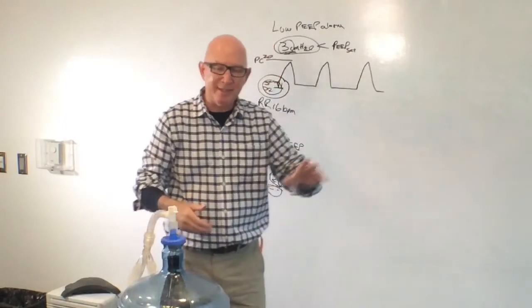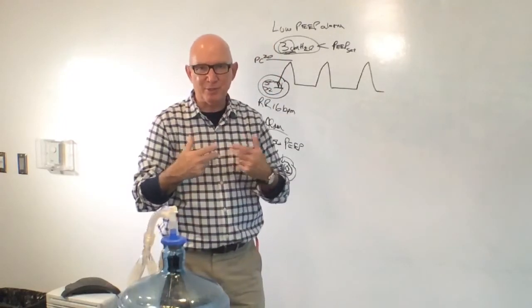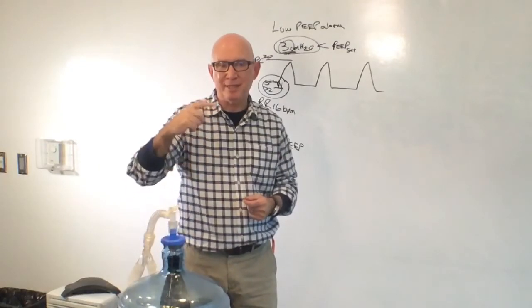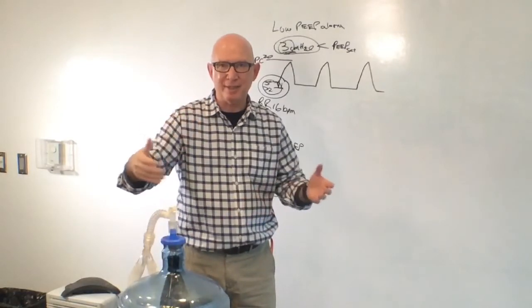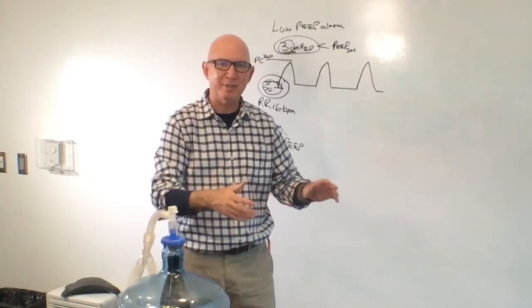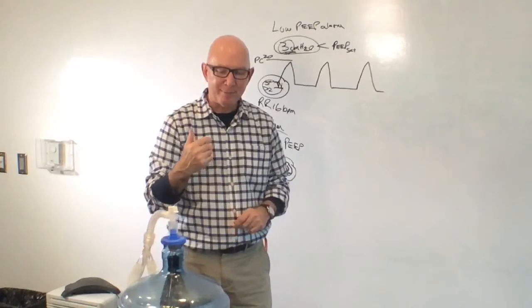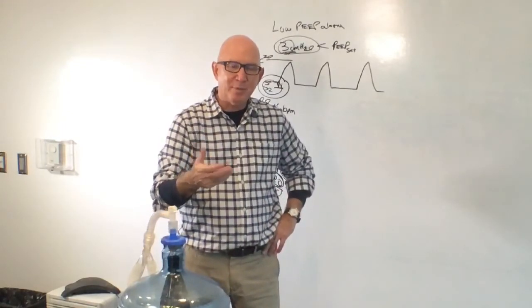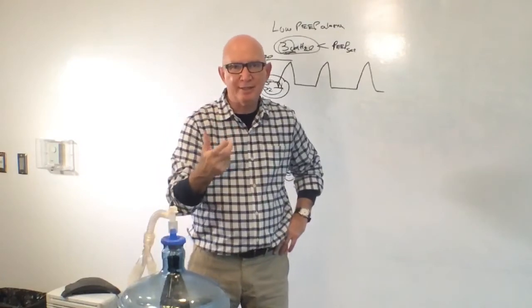So I'm not going to get into that because that gets out of my particular realm of expertise. And as Sean said earlier, we're going to set up a CME that's dealing specifically with sedation of ventilated or transported patients, which will address some of those things. So I'm not going to go in that particular direction. But when we ventilate our patients, it's important for us to appreciate what can cause asynchrony.